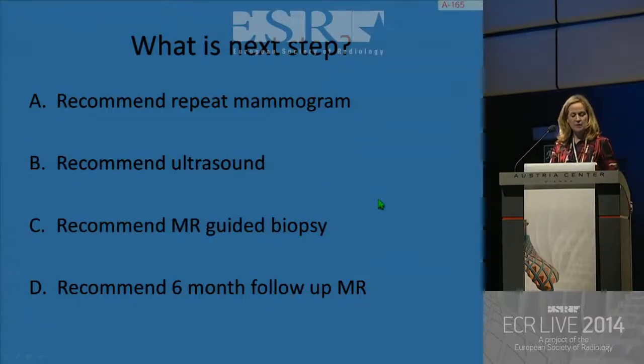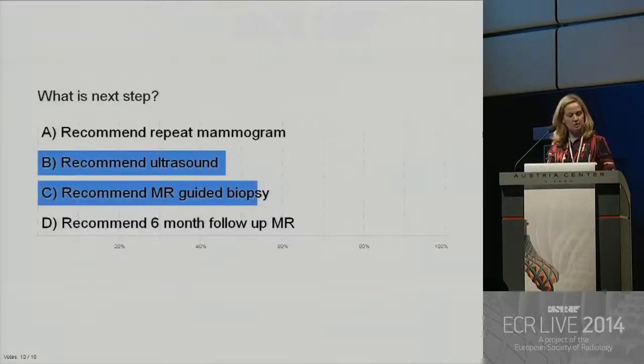Do you A, recommend a repeat mammogram, B, recommend ultrasound, C, recommend MR-guided biopsy, or D, recommend a 6-month follow-up MR? Can you please vote? And can I see the answers, please? Actually, the answer is B. You recommend an ultrasound. It's called a second-look ultrasound.